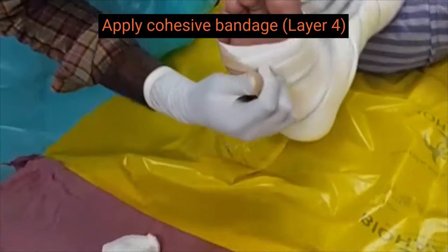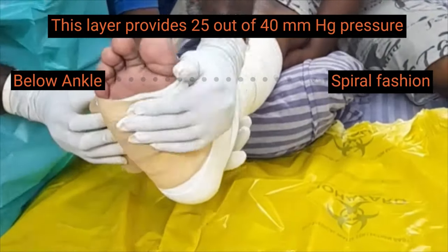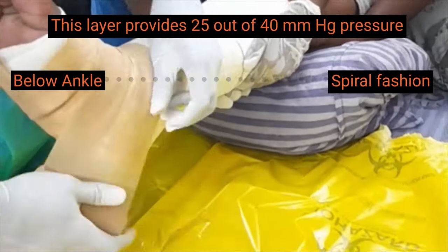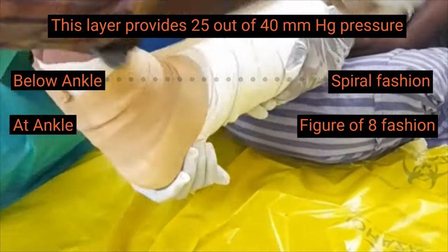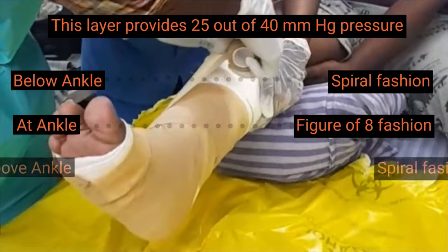The fourth layer is a cohesive bandage. The last layer is applied like the second layer. This layer provides 25 out of 40 mmHg of pressure produced by the system. The last layer does not require tape to secure it.